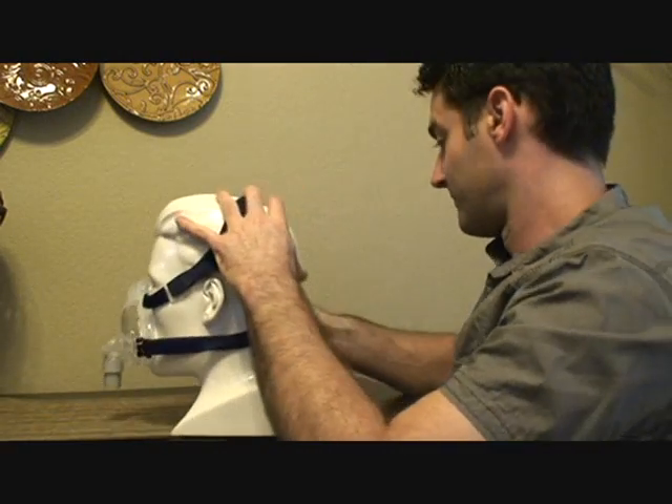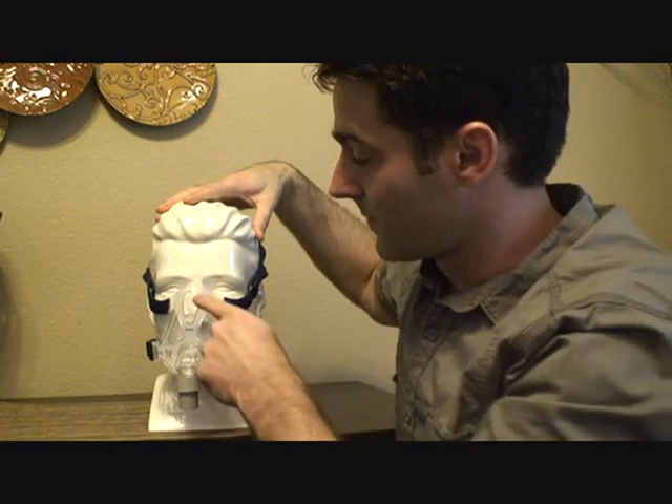I find it's best to do this with the pressure on, because you can actually hear it leaking. If you pull it tight and it stops, you know you've got it. Here's the diffuser where all the air comes out — it's very quiet and disperses air really well so as not to disturb your bed partner.